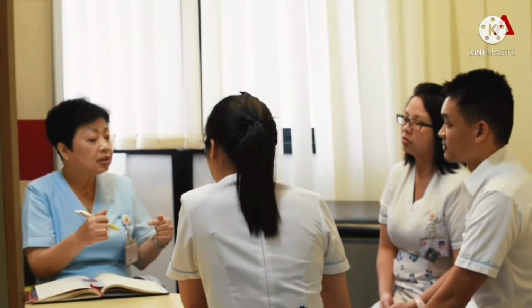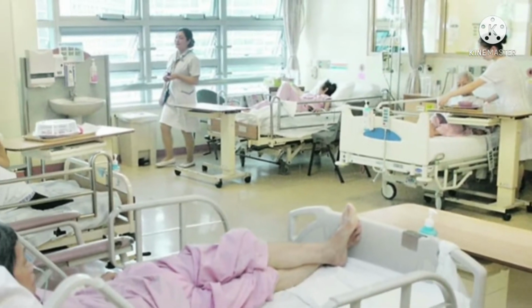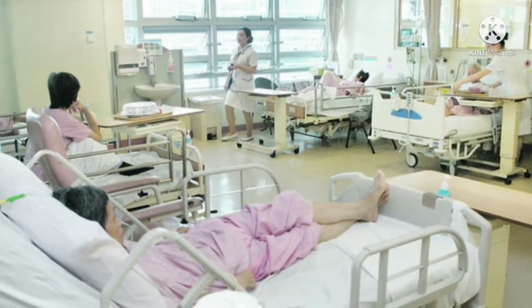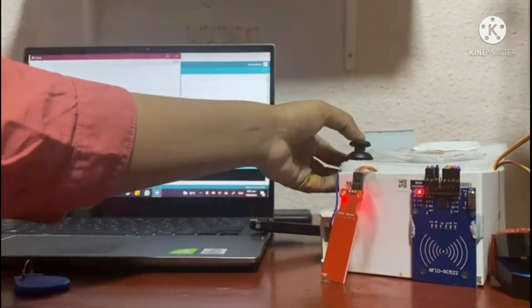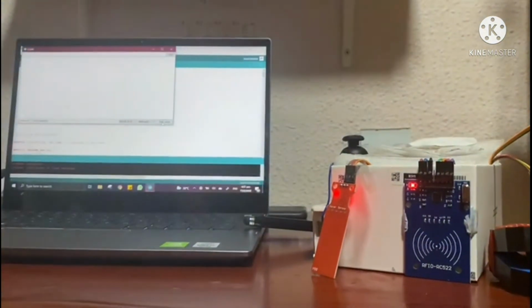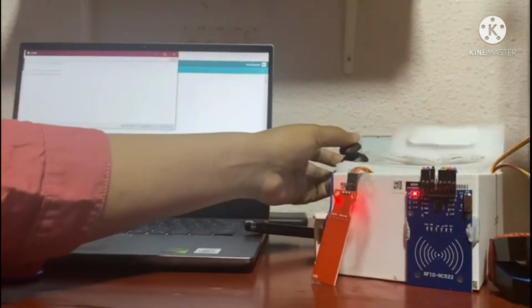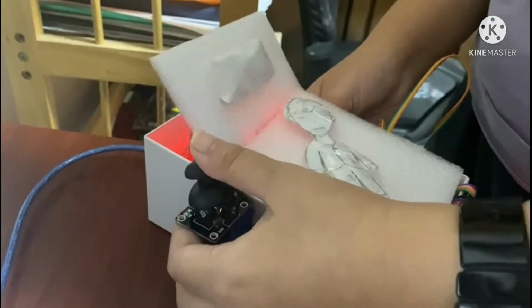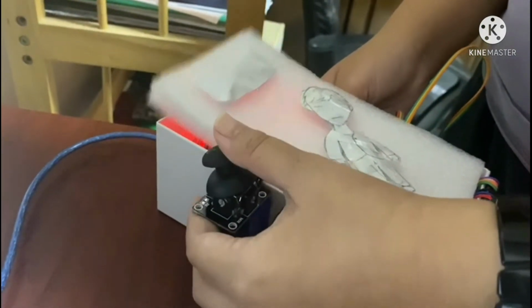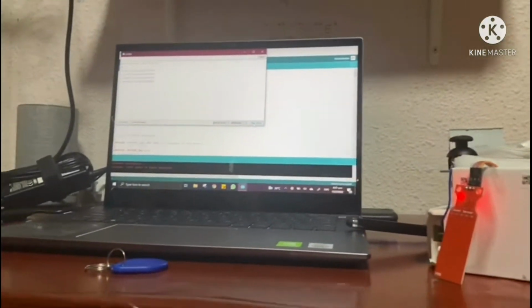After interviewing an intern at the nursing industry, we came up with a system that is more convenient for nurses and patients. Once a patient is admitted and place his or her tag on the RFID reader, all sensors will start to read data. If no tag is detected, it means there's no patient on the bed. We have added a reclinable bed for the patient and set the joystick conveniently nearby to adjust according to their needs.